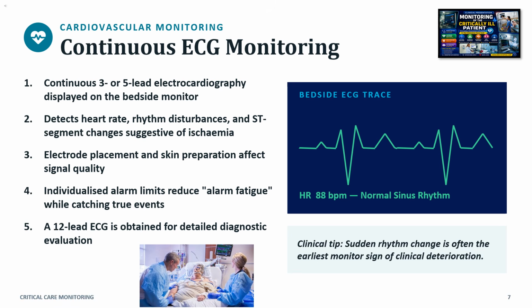Cardiovascular monitoring. Continuous ECG monitoring. 1. Continuous 3 or 5 lead electrocardiography displayed on the bedside monitor. This provides real-time visualization of cardiac electrical activity. 2. Detects heart rate, rhythm disturbance, and ST segment changes suggestive of ischemia. This allows early identification of arrhythmias and myocardial injury.